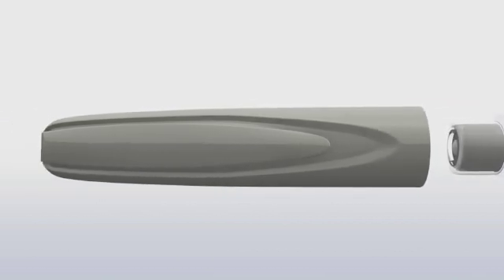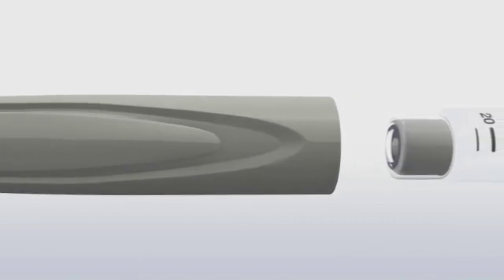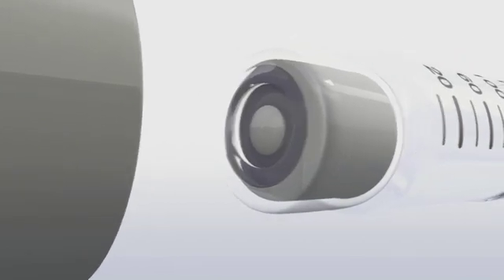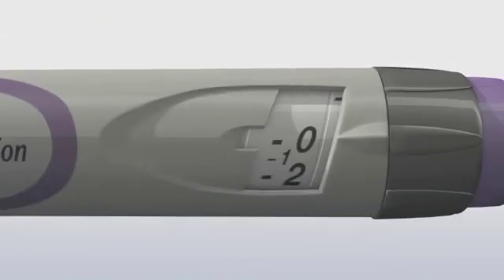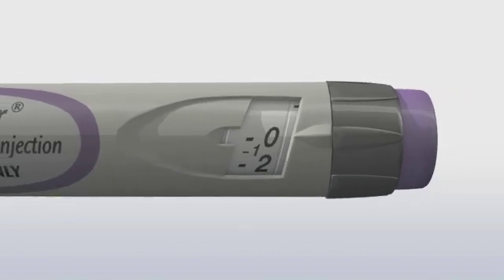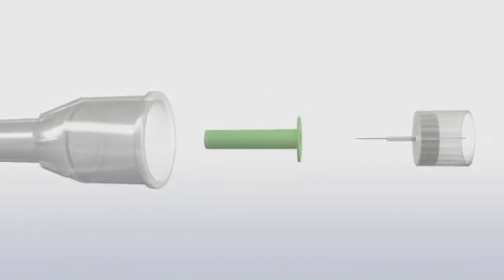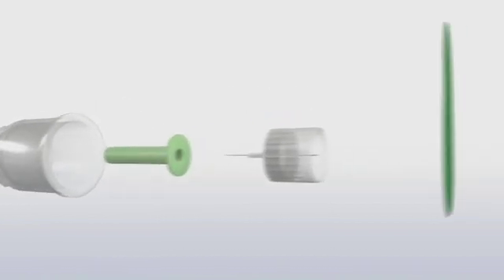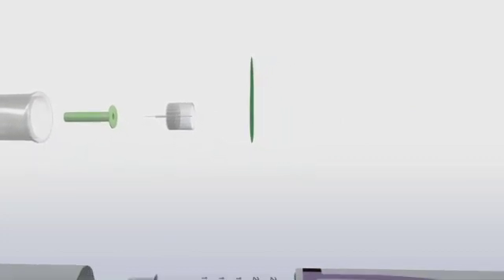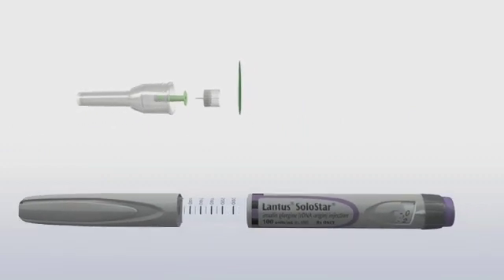This is the pen cap. The pen cap protects the pen when you're not using it. When you remove the cap, you can see the rubber seal, which protects the insulin in the pen reservoir. The dose window has large, easy-to-read numbers so that you can clearly see the dose you're dialing. The pen needle has an outer cap, an inner needle cap that covers the actual needle, and a protective seal. Pen needles are not included with the pen. Lantus Solostar is compatible with Becton Dickinson Ultrafine pen needles.